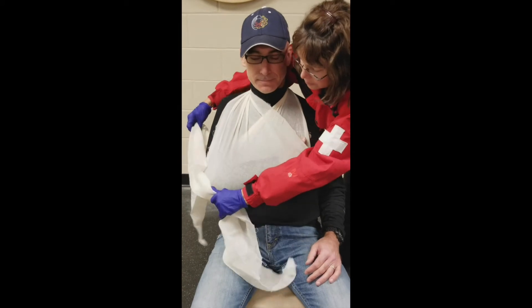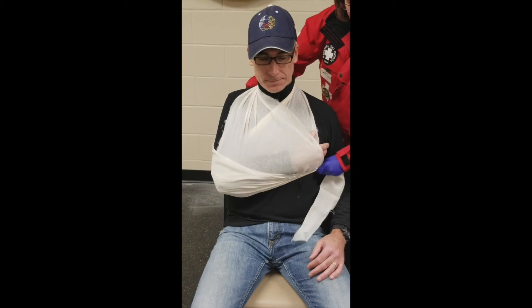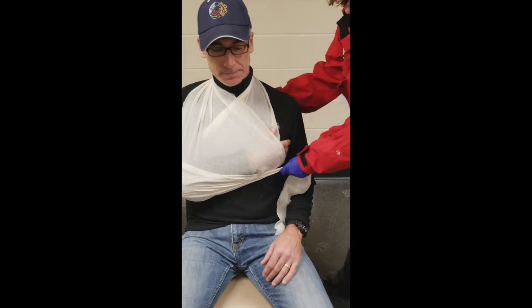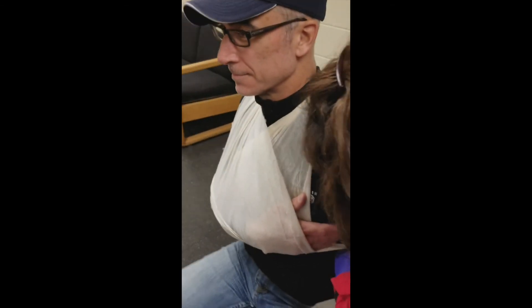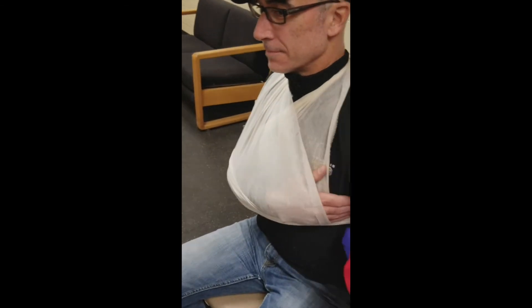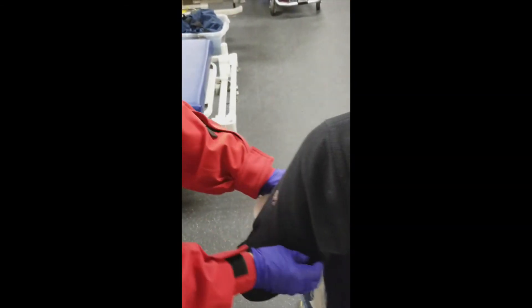I'm going to cup the elbow with this part of the cravat and go around here. You could lean forward a little bit. We're going to tie this — can you breathe okay? Take a big breath. We're going to tie this swathe right up here under the arm, nice and snug. Make sure they can breathe okay though.